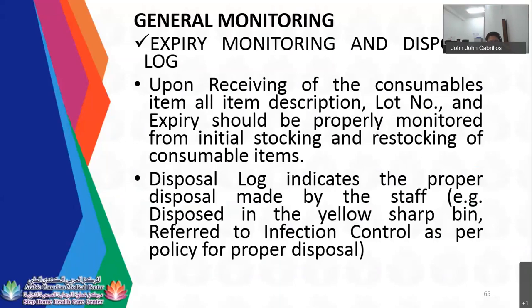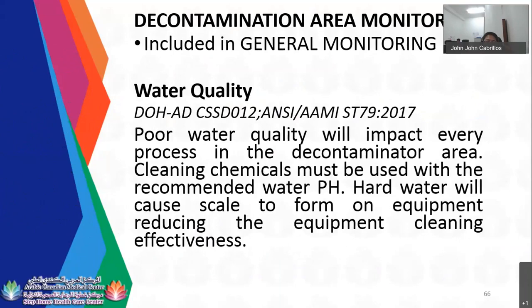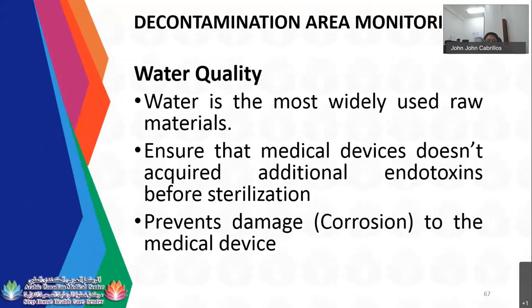So for your water quality test, so as per the new updates, poor water quality will impact every process in the decontamination area. So cleaning chemicals must be used with the recommended water pH. Hard water will cause scale to form on equipment, reducing the equipment cleaning effectiveness. So water is the most widely used raw material in CSSD. So you need to ensure that medical devices don't acquire additional endotoxin before sterilization. That's the reason why you need to monitor the water quality of whatever water you are using in CSSD. So it will prevent damage or corrosion to the medical device.